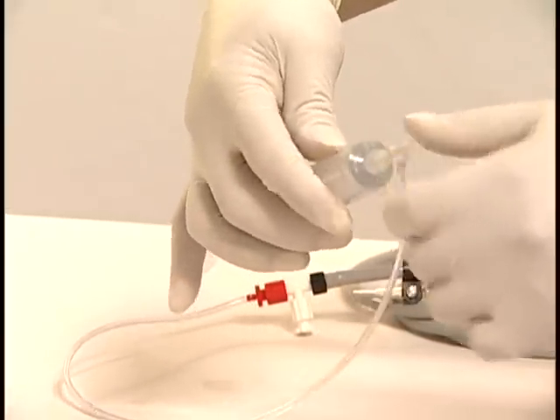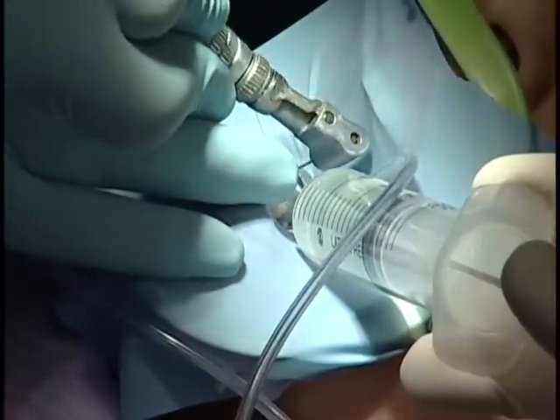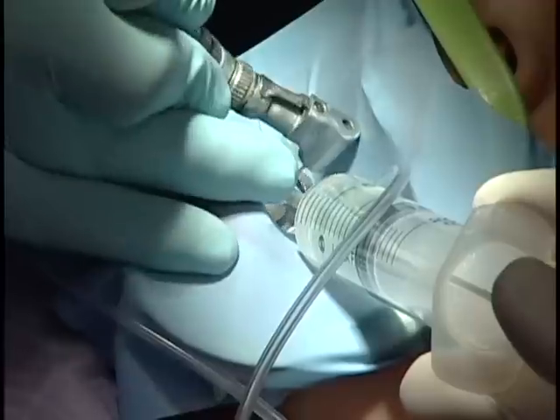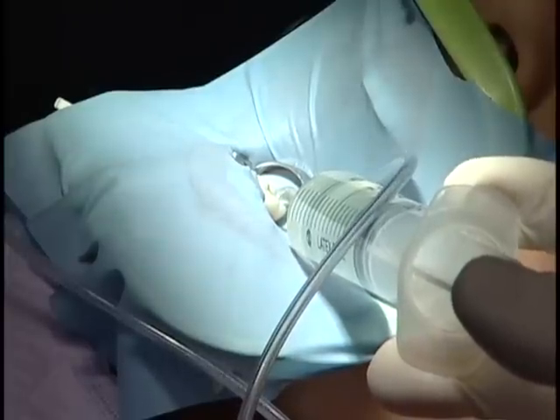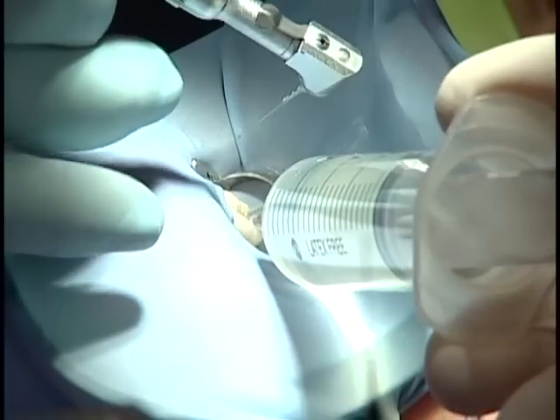The master delivery tip allows me to really irrigate the pulpal chamber without the fear of spilling into the patient's mouth, because it's evacuating excess irrigant at the same time that I'm delivering the irrigants, which in this case is sodium hypochlorite. I've also double-bibbed the patient to ensure that we don't damage any of the patient's clothing. Notice how the gross debris is evacuated out through the master delivery tip.